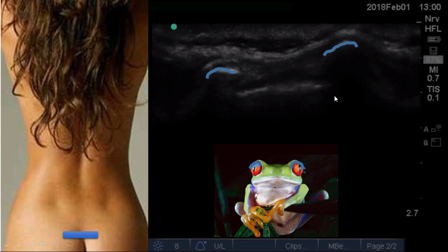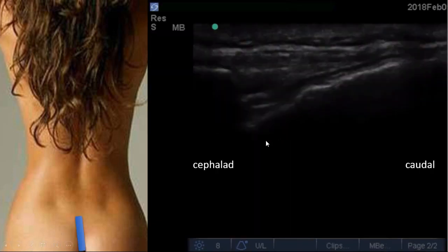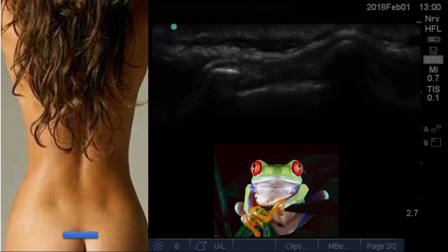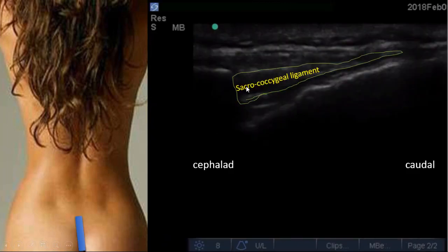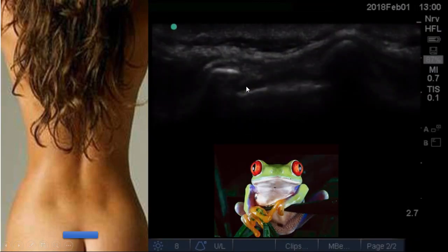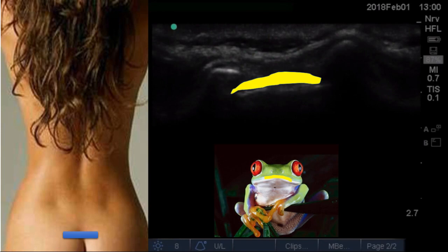Look at the appearance: these two hyperechoic structures are the two sacral cornua, and the caudal epidural space is shown in yellow. You can remember this picture by the analogy of the frog face — the two cornua are the eyes and the epidural space is in the center.